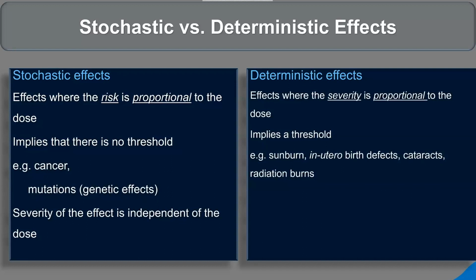And we have sunburn there, not because we want to equate our x-ray to a day in the sun. Never want to do that. But a sunburn is a deterministic effect. So if you walk outside for 15 minutes, you're probably not going to get a sunburn. You sit outside for 4 hours, you're probably going to get a sunburn. So it's a time-dependent deterministic effect, very similarly to what we see with our ionizing effects.